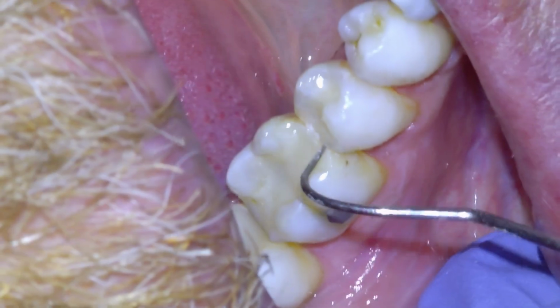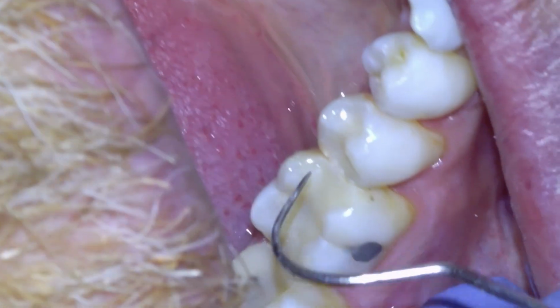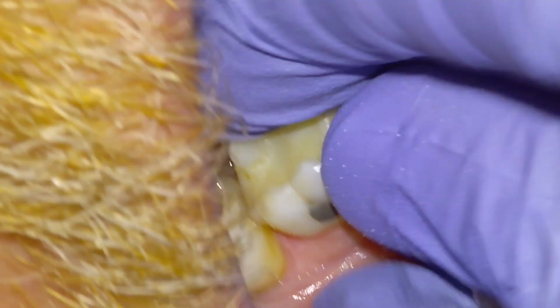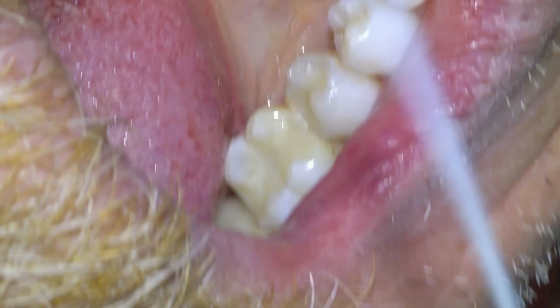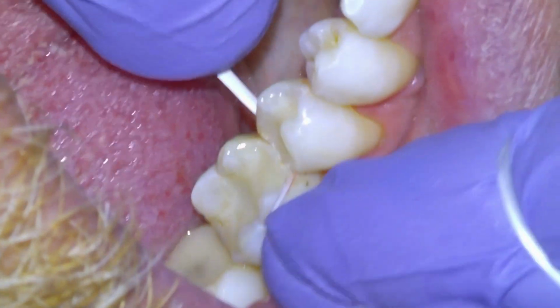We're going to make sure we can get in with the floss, give it a quick floss to check the contact, and then we'll dismiss the patient. Tell them that there's a chance of developing pulpitis, but this one fortunately did well. And that's that one.